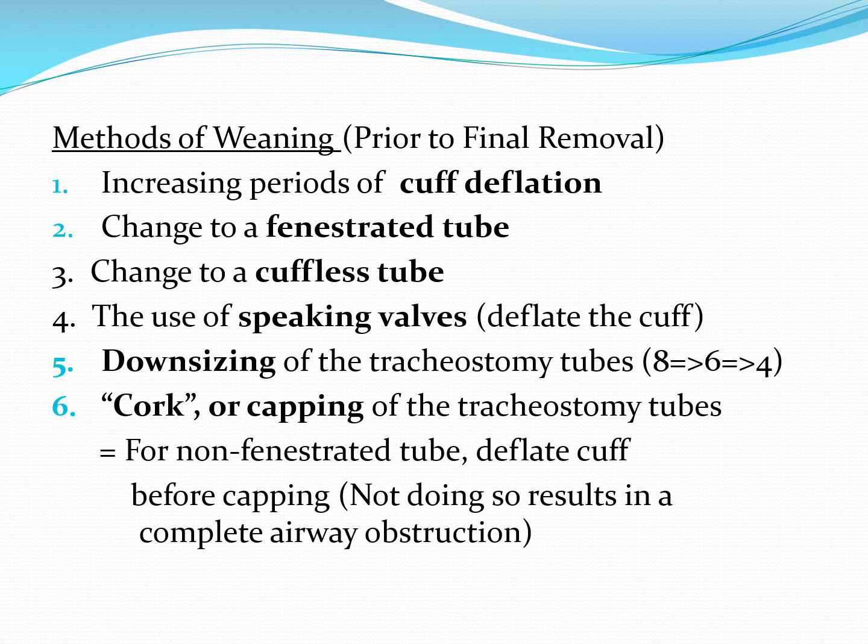So the patient would have to be successfully weaned off of mechanical ventilation, generally for a number of days. It may be a practice to deflate the cuff as soon as they're off of mechanical ventilation. The caution there would be if the patient cannot protect their airway, as you may see with a patient who's got paralyzed vocal cords, some other issue, or they may have had head and neck surgery and they're getting a lot of drainage from that. And the physician and the surgeon do not want the patient to aspirate.